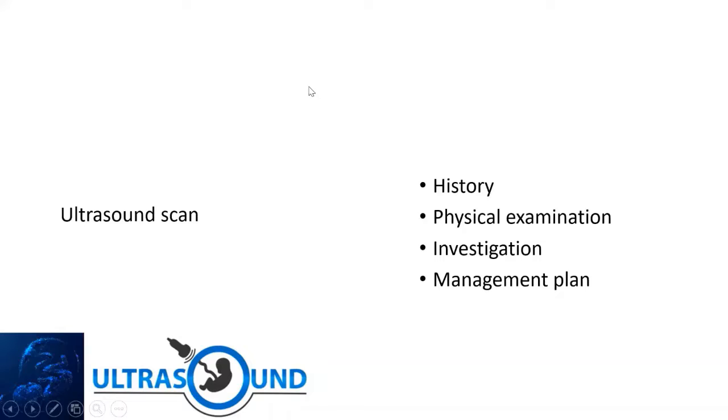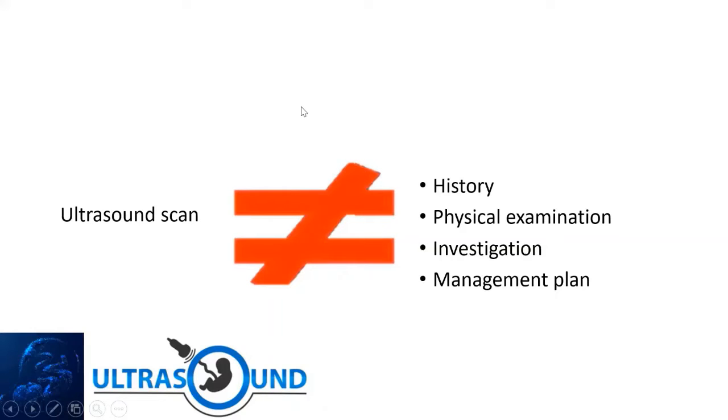So one thing that I would like to let you know is that ultrasound scan is not equal to history, physical examination, investigation, and your management plan. Ultrasound is actually an adjunct to help us achieve a diagnosis, rather than ultrasound replacing these four fundamental assessments.